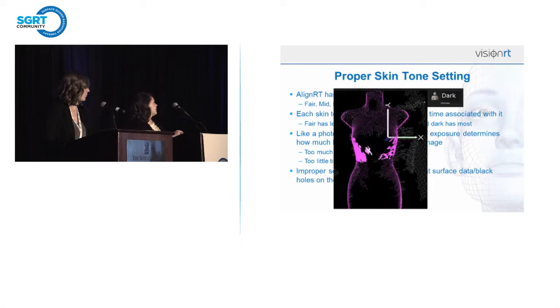This picture is our Emily Phantom. And if anybody's seen her, her surface is white, but we've used the dark skin tone setting to capture this reference.